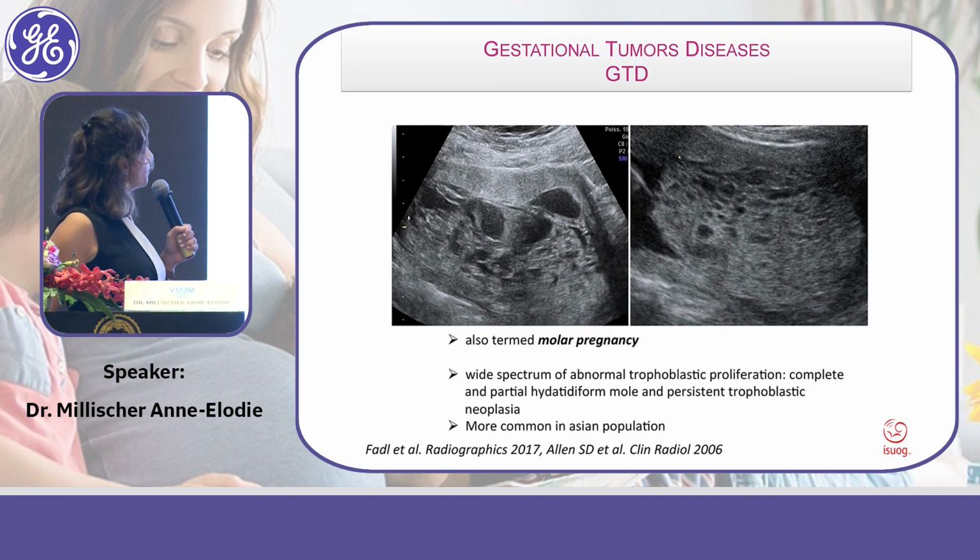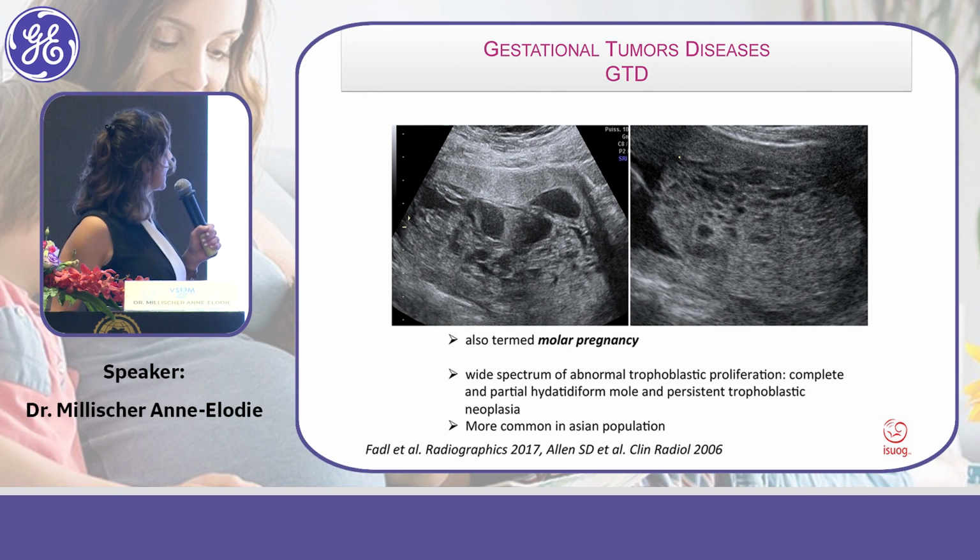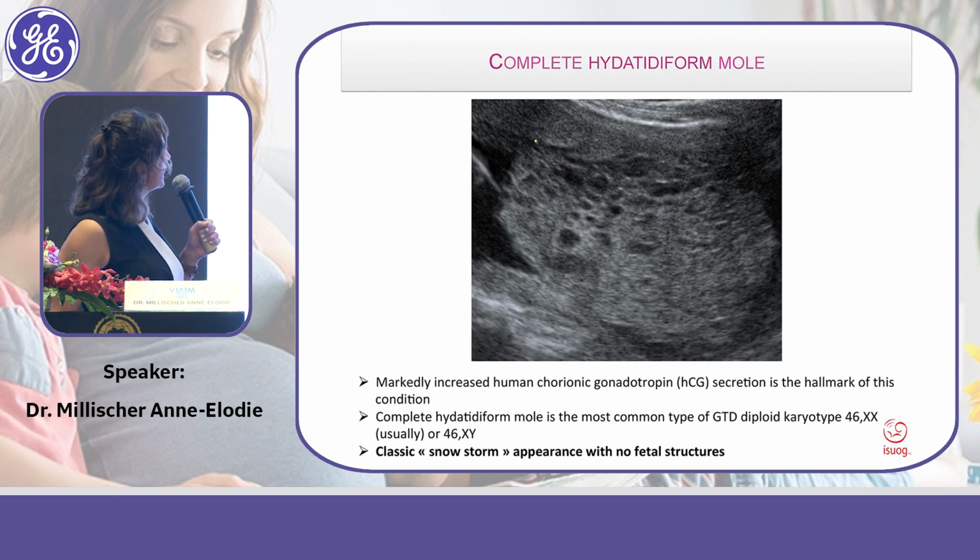It can be complete or partial. And here an example of complete hydatidiform mole.